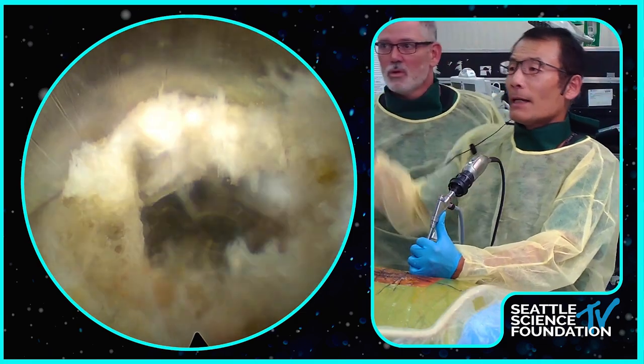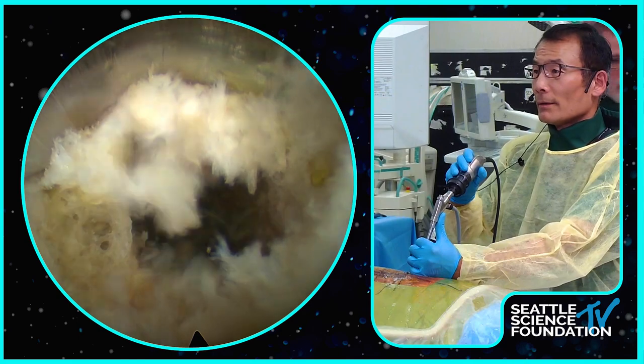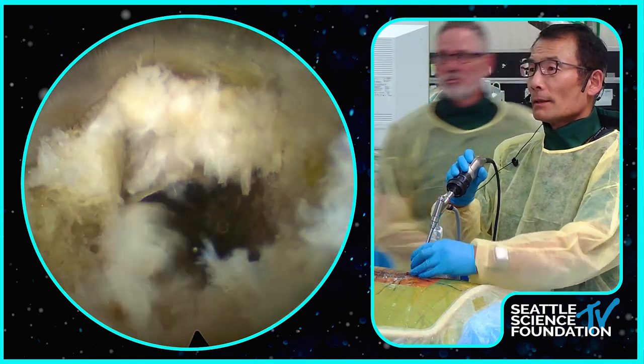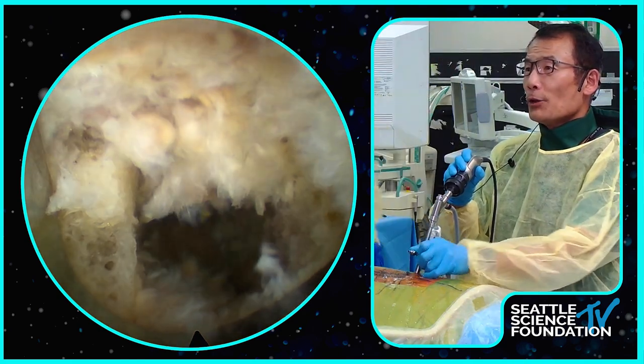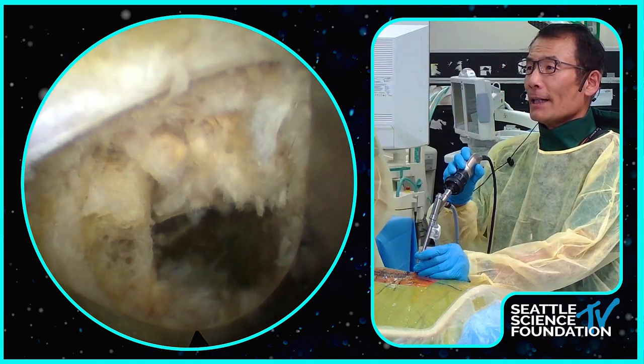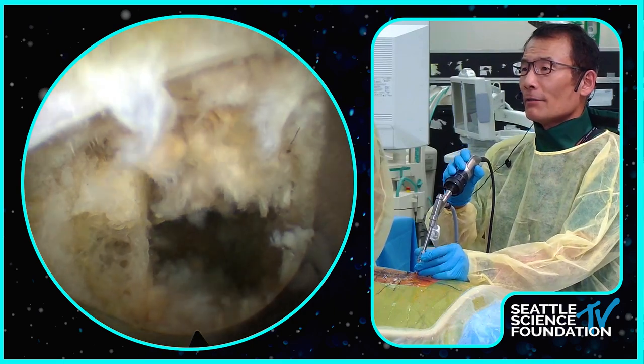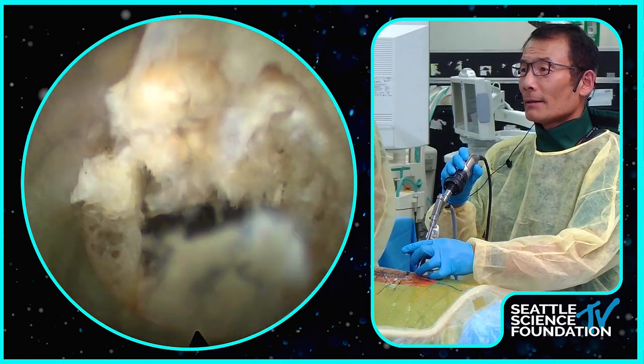Not quite. Okay, so you can bring the x-ray here, bring a lateral. I'm going to put the cage in. How is the irrigation working? Yeah. So, once again, during your work, if you have to do retraction, just periodically retract it, turn it back, give the traversing nerve root a break.